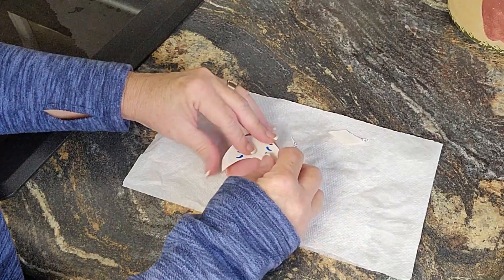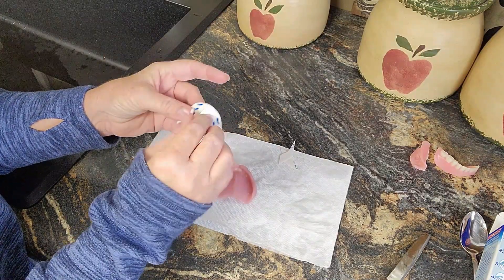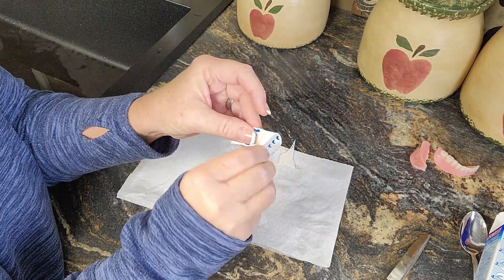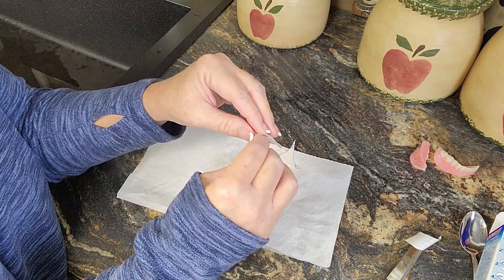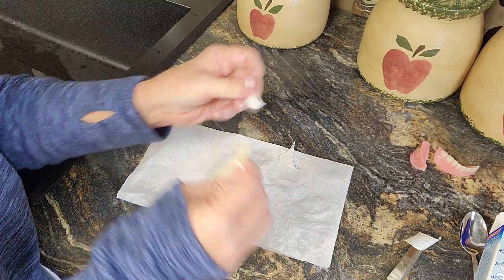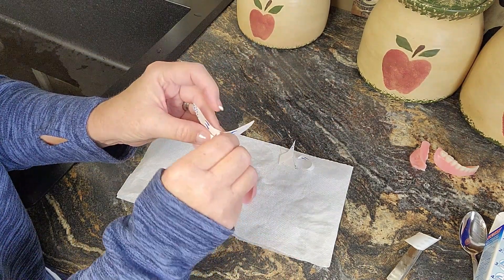Then it's going to go in here. It says to wait 15 minutes before you eat or drink. I had trouble peeling these last time, but I can tell you on my lower denture this was awesome — this worked really, really well. I really did like this. Let's see how it does on the upper denture.